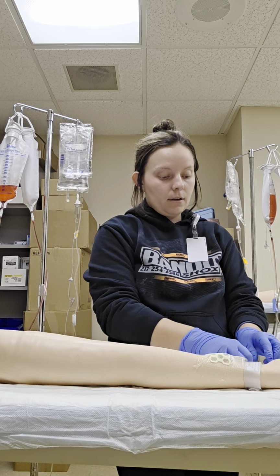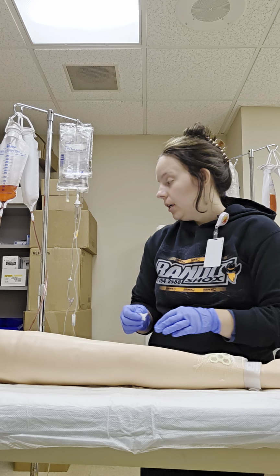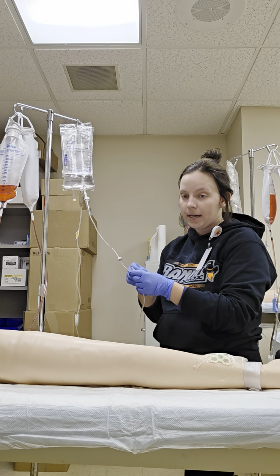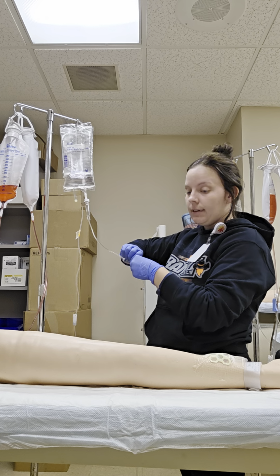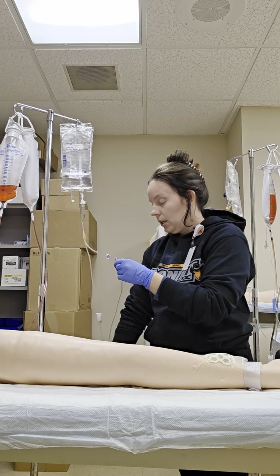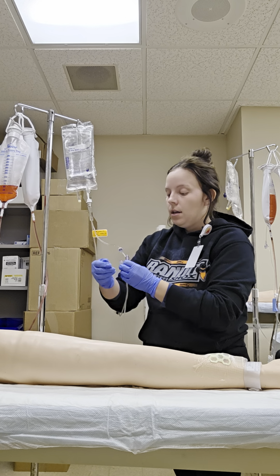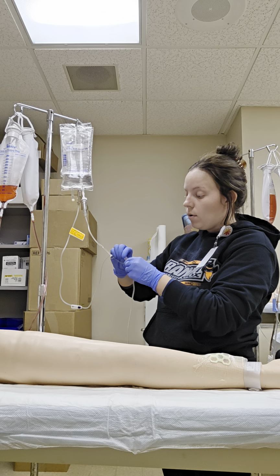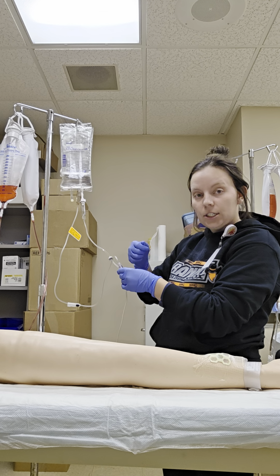Alright, gloves are on, so I'm going to go ahead and take my alcohol here, and I'm going to swab the upper Y port on my primary line. So I'm going to swab it 10 times. So 1, 2, 3, 4, 5, 6, 7, 8, 9, 10. I'm going to grab my secondary tubing. I'm going to remove the cap, and I'm going to connect my secondary tubing to my upper Y port here, making sure that I'm not touching the inside of it or what I just cleaned.